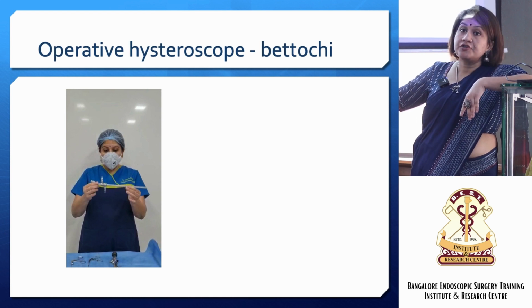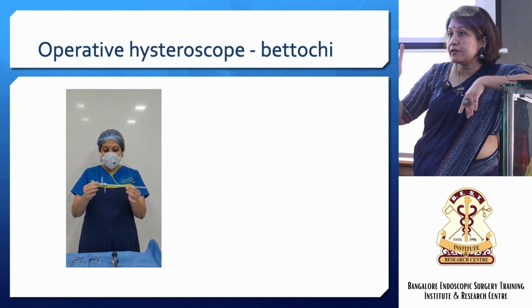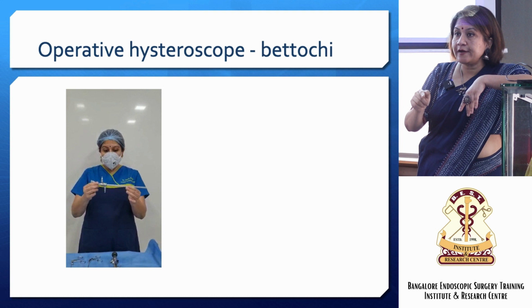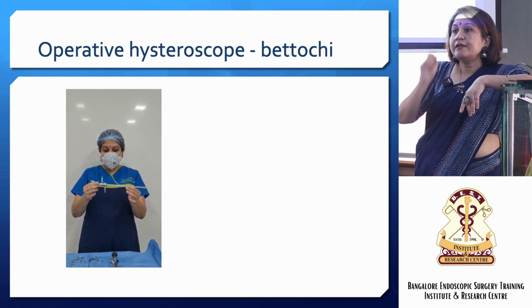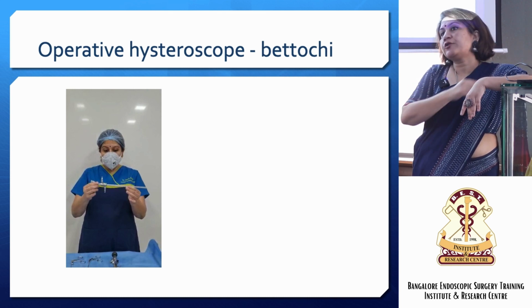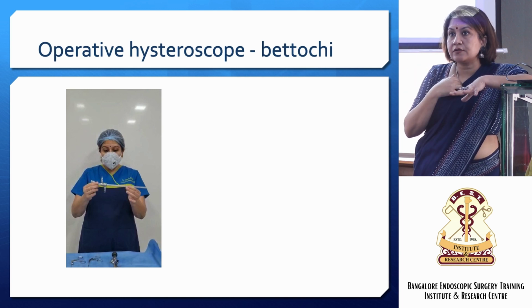The newer one, which I made Cloud9 buy, is supposed to be from Storz. So whenever you are investing, I want you to check if there is another model. What they have done is, outflow is fine, but for the inflow and the instrument, there's a common entry. So every time I put an instrument, my vision goes. And that's why I keep going back to my own personal telescope. So I don't know, that particular model which I have in Cloud9 is bad.